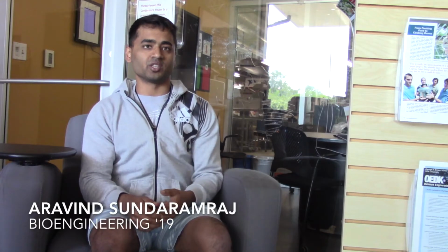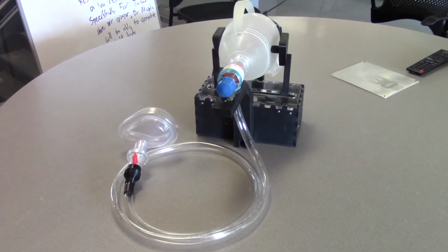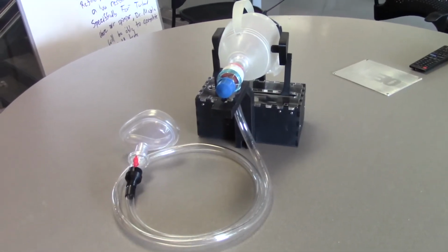When designing the device, there were several criteria we had to consider. First, we wanted it to be low cost, since this is for low resource settings. We also wanted to have good control of the breaths per minute and the volume provided, so that we can provide sufficient ventilation. We also wanted to limit size and weight of the device so that it can be portable. Additionally, the device needs to last for a long time, so it can be a proper replacement for the ventilator. And finally, we wanted to limit power usage, since these are low resource settings and power may not always be available. So this is our device, the automated bag valve mask.